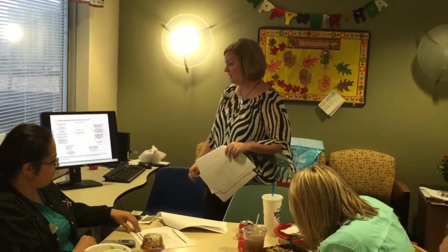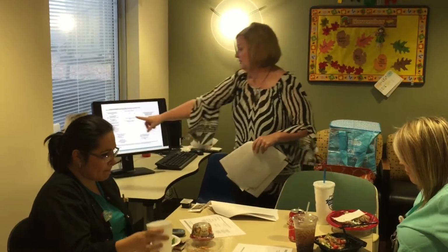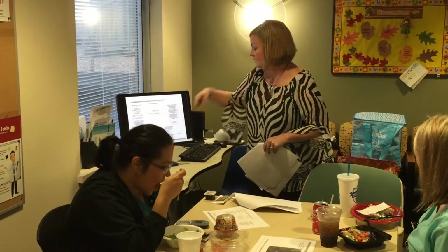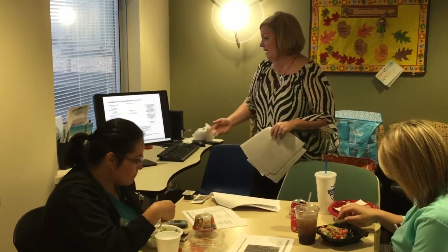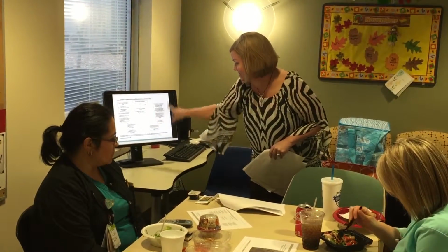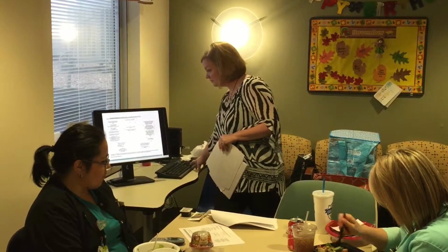So, we deal with a lot of code situations on our floor, and codes with an LVAD patient are a little bit different. Again, we talked about not doing the compressions unless ordered by the physician. So you want to know if the alarms are activated. There are alarms on the machine. You can do cardioversion to convert them. And I'm not going to go through the whole thing because I put some copies down there, but it is different from the traditional code blues that we deal with.